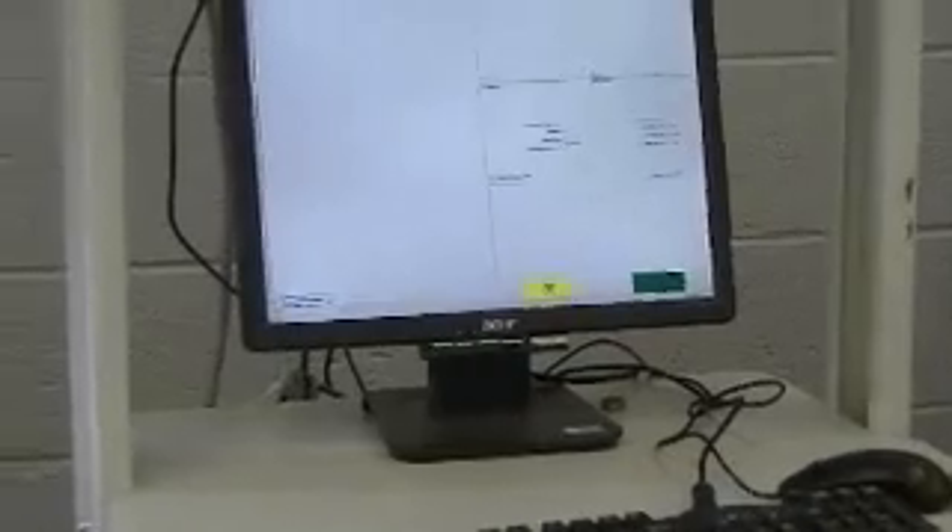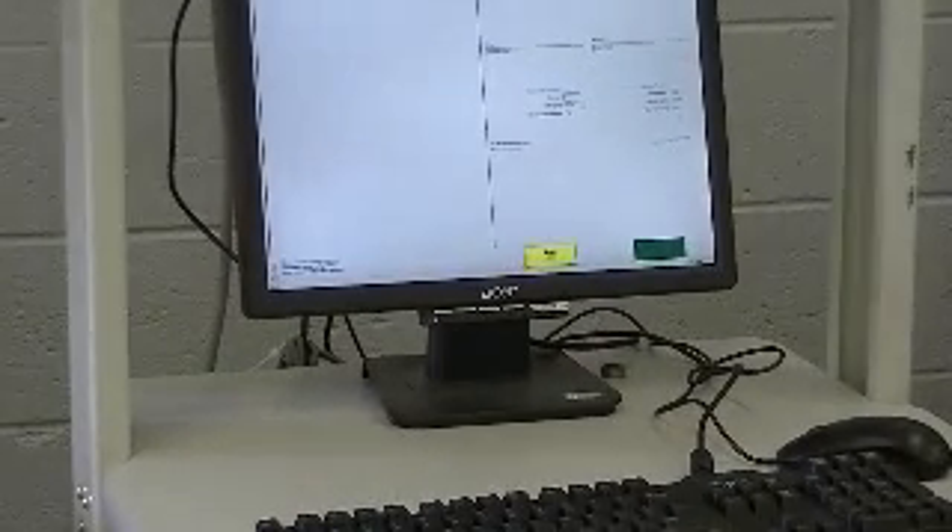Once you have it lined up, go back to the workstation and select OK or Start.